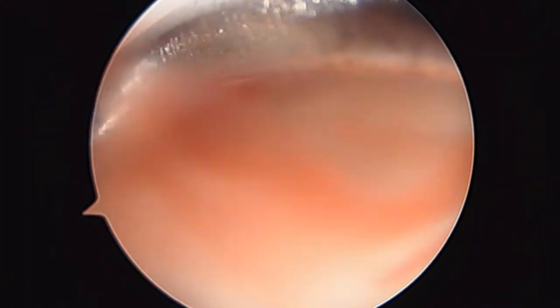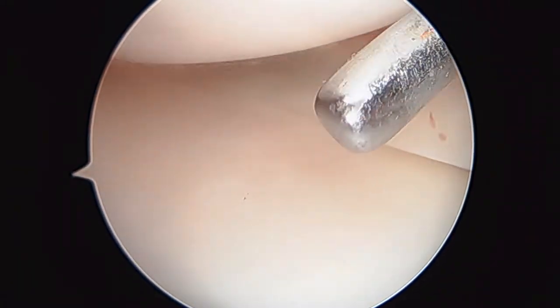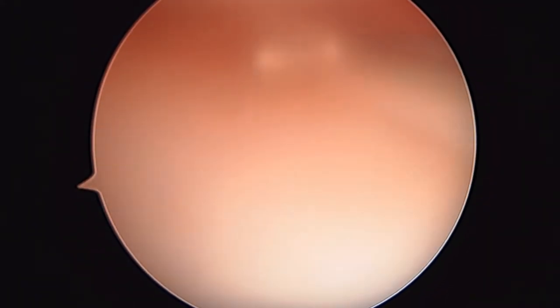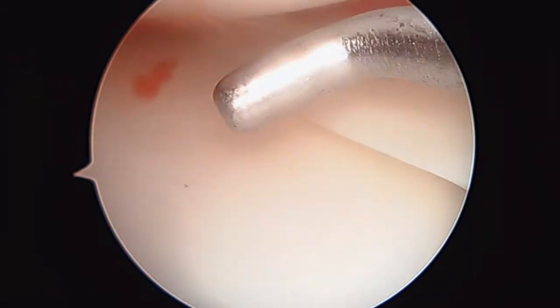Hi, it's Dr. Buford. We're just getting started on the right knee. We're looking in the medial compartment. We've already harvested some nice hamstring tendons and we've actually already harvested some bone marrow to make the bone marrow concentrate injection at the end of the case. So here we're just getting our first look in the medial compartment.